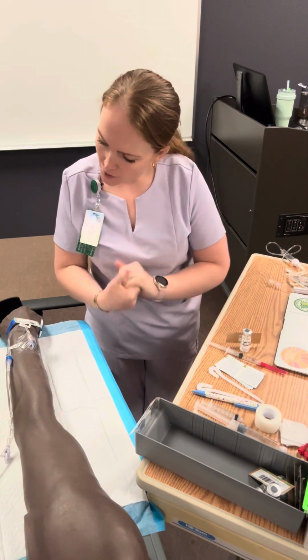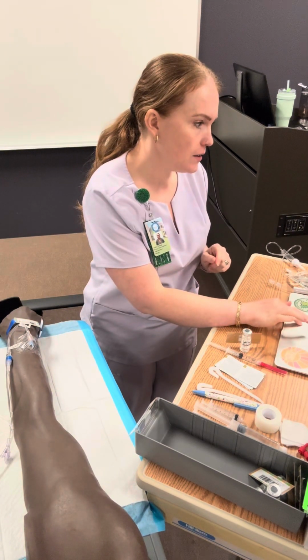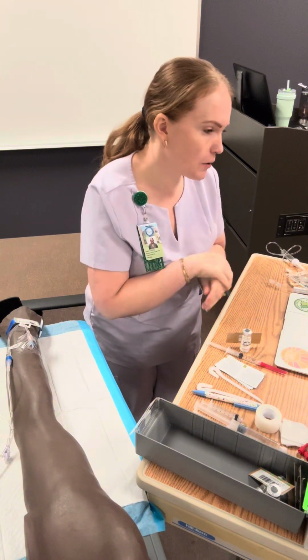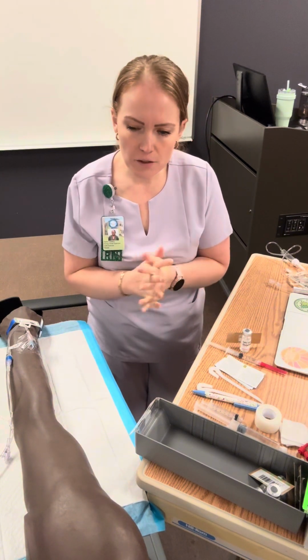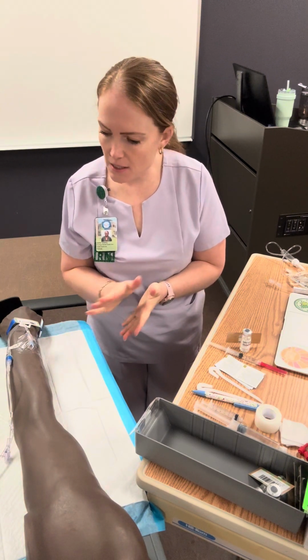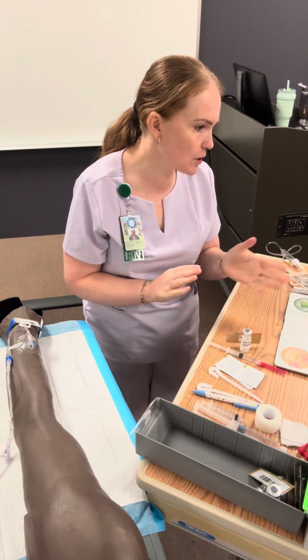Thank you. Code Brown 61851. I'm just going to double check that over here. And Code Brown 61851. Okay, and tell me again, do you have any allergies to anything, and you're not sensitive to tape, correct? No allergies, not sensitive to tape. Okay. And I'm just double checking that is in the system, no allergies.